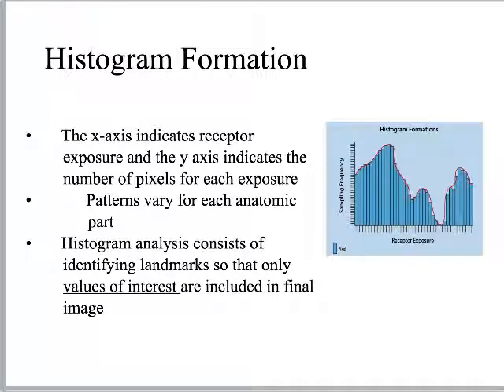And these values, these pixel count values, are going to be really high. Why? Because they map right onto the bit depth. So however deep the pixels are, however much information the pixels can receive, that's how much information can be represented on the histogram. So they're really large numbers.